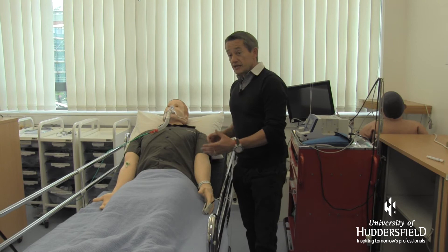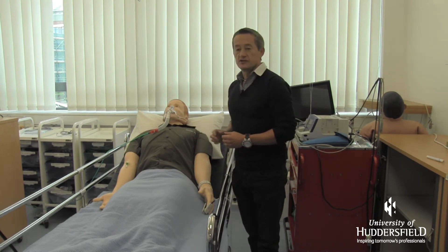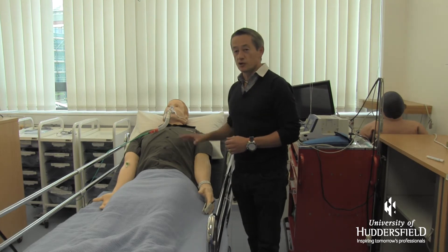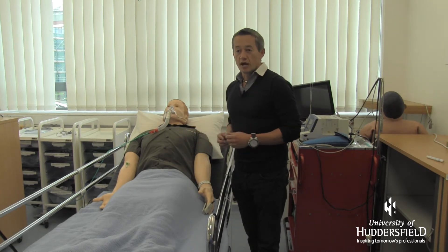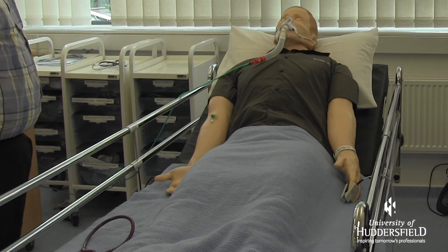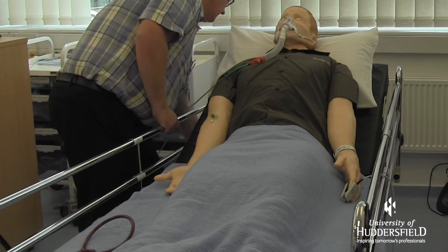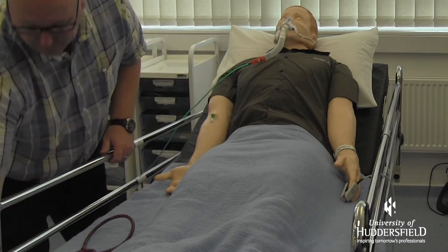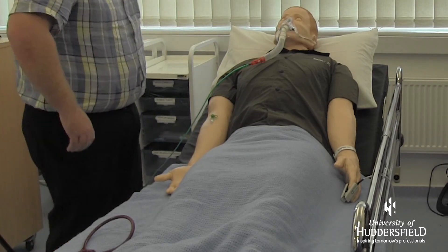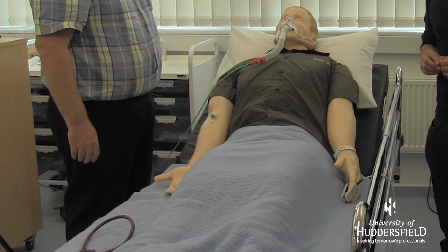If he continues to deteriorate because the management isn't appropriate, he may eventually stop breathing, and that's what I'm going to demonstrate now — I'm going to actually stop him breathing. On our monitor, we can see that his heart rhythm has completely changed and he's in a life-threatening rhythm. Alarms are starting to sound, he's got no blood pressure, he's got no pulse, and if we look, his eyes are shut and he's stopped breathing.